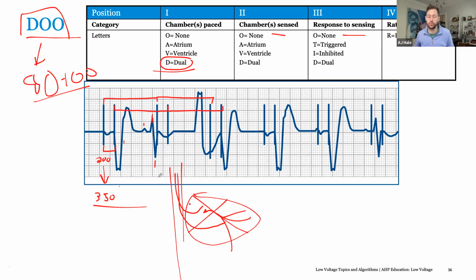Those are the kind of things where, I think it's important when you're dealing with pacemakers, you don't always have a template of what to do. It's more about understanding generally what the device is going to do, its actions, and then planning accordingly. Sometimes people who are inexperienced programming devices can put patients into dangerous situations because they're trying to fit a mold that doesn't necessarily fit the specific patient. So you have to tailor programming to the patient, to the circumstance, and to existing programming.